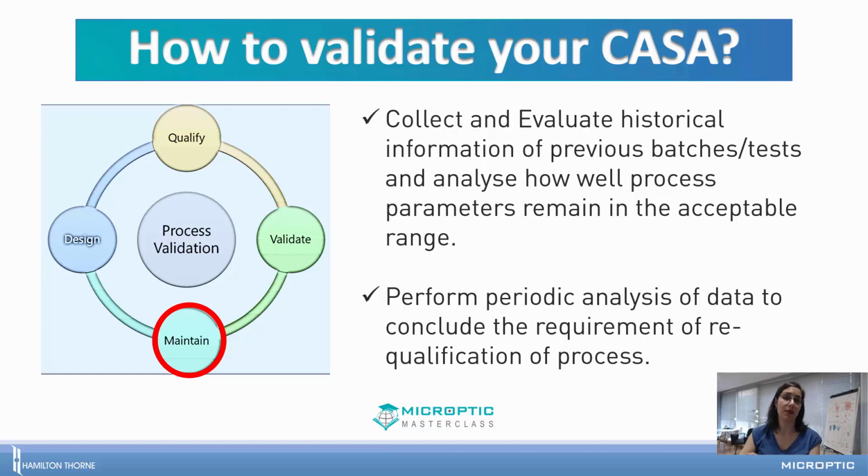So here it is important to collect information concerning internal quality controls, running QC samples to check that results are not changing, and to run annual external quality controls, to check that the system is used and working as expected according to its intended use and all the expectations specified by the manufacturer.